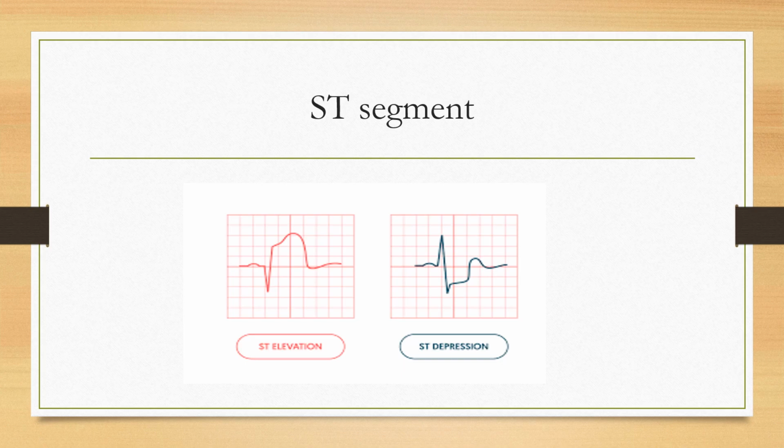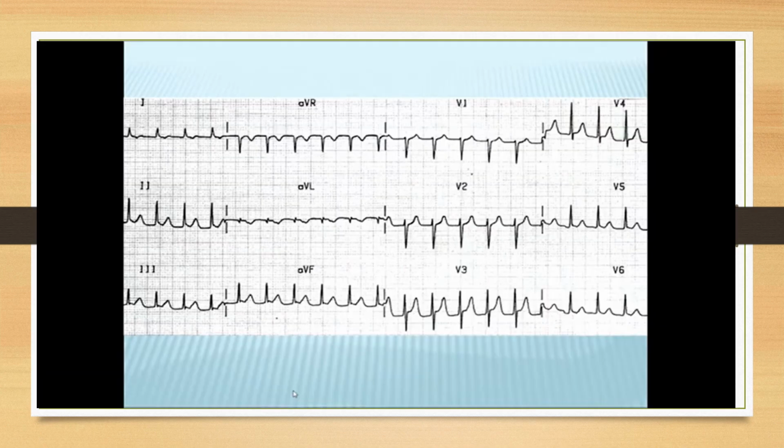ST segment. So ST segment is an isoelectric line. It is the more grave condition when there is elevation of the ST segment instead of depression of the segment, and it gives us information about acute myocardial infarction. If you see on ECG that ST segment is elevated, you can close your eyes and clearly say about acute myocardial infarction. Now, today I want to stop with this ECG interpretation.